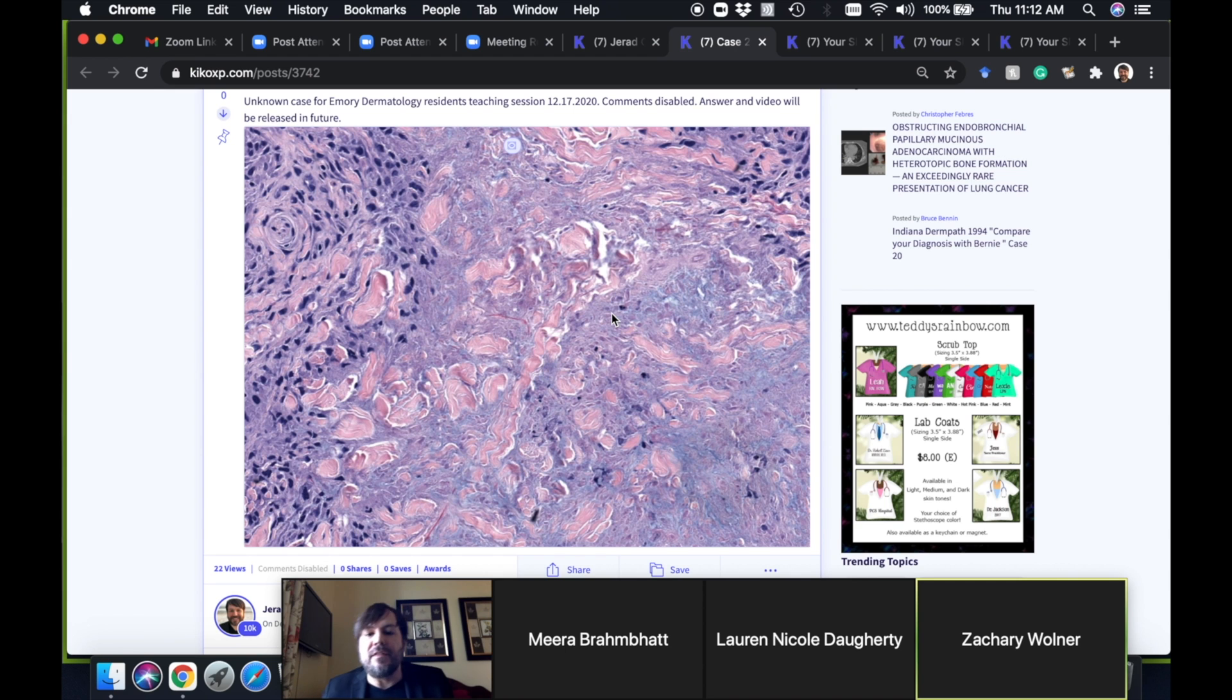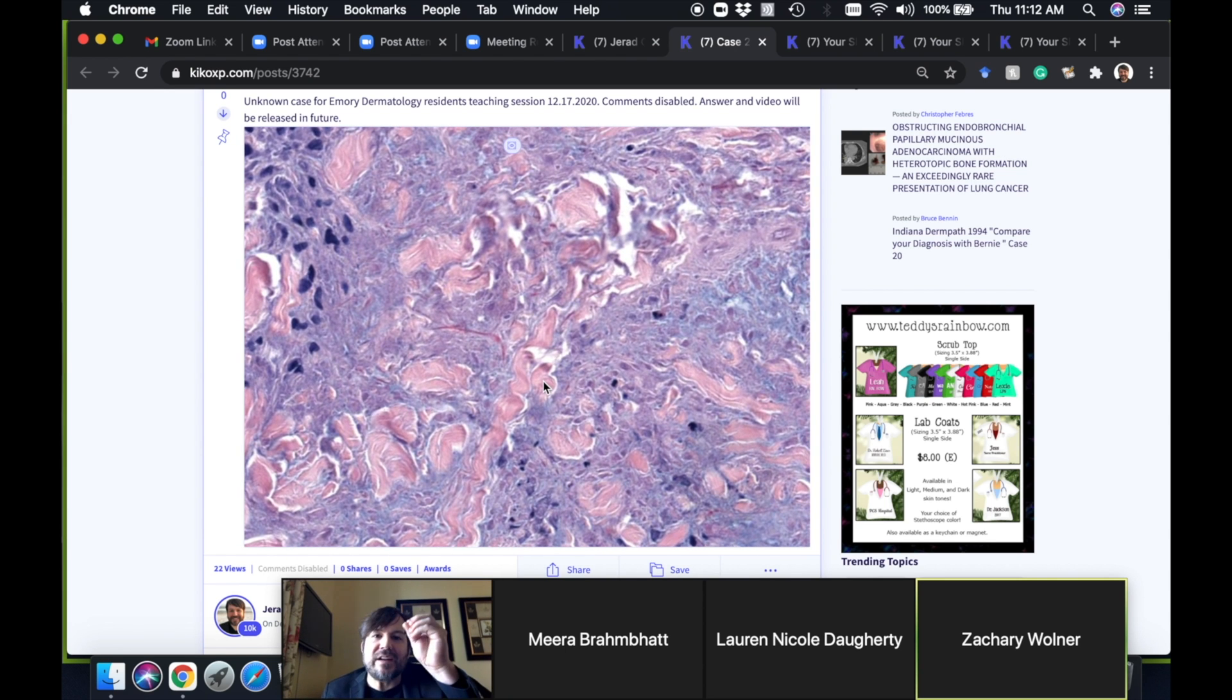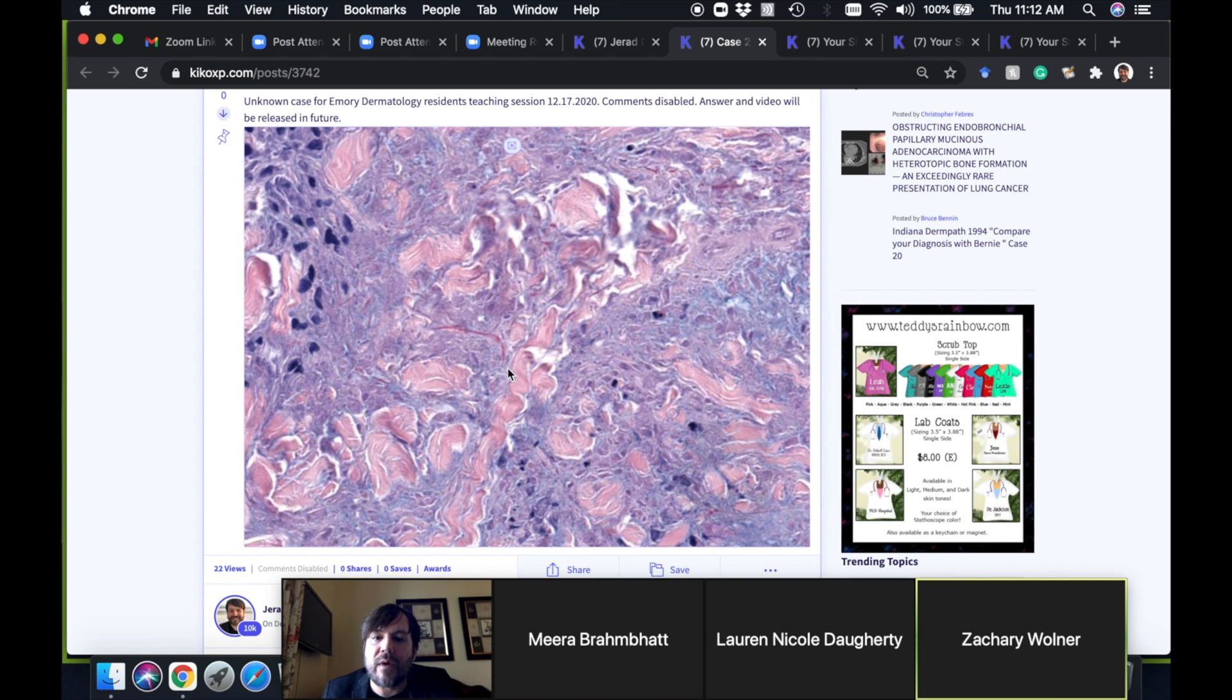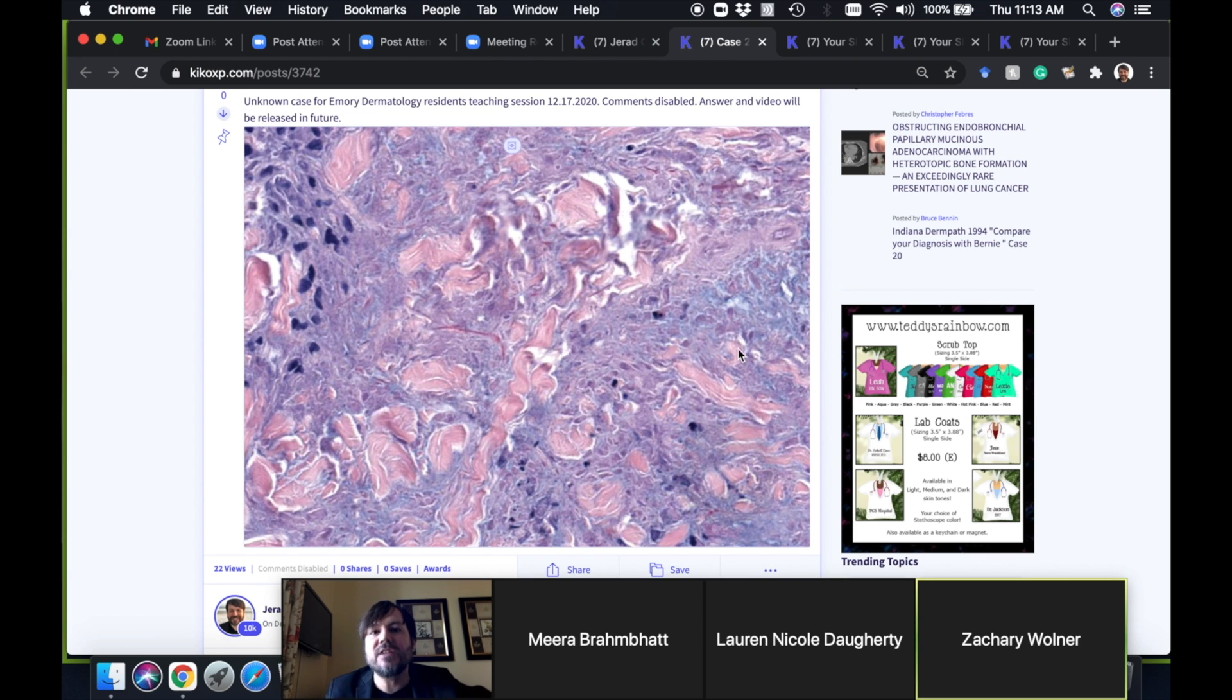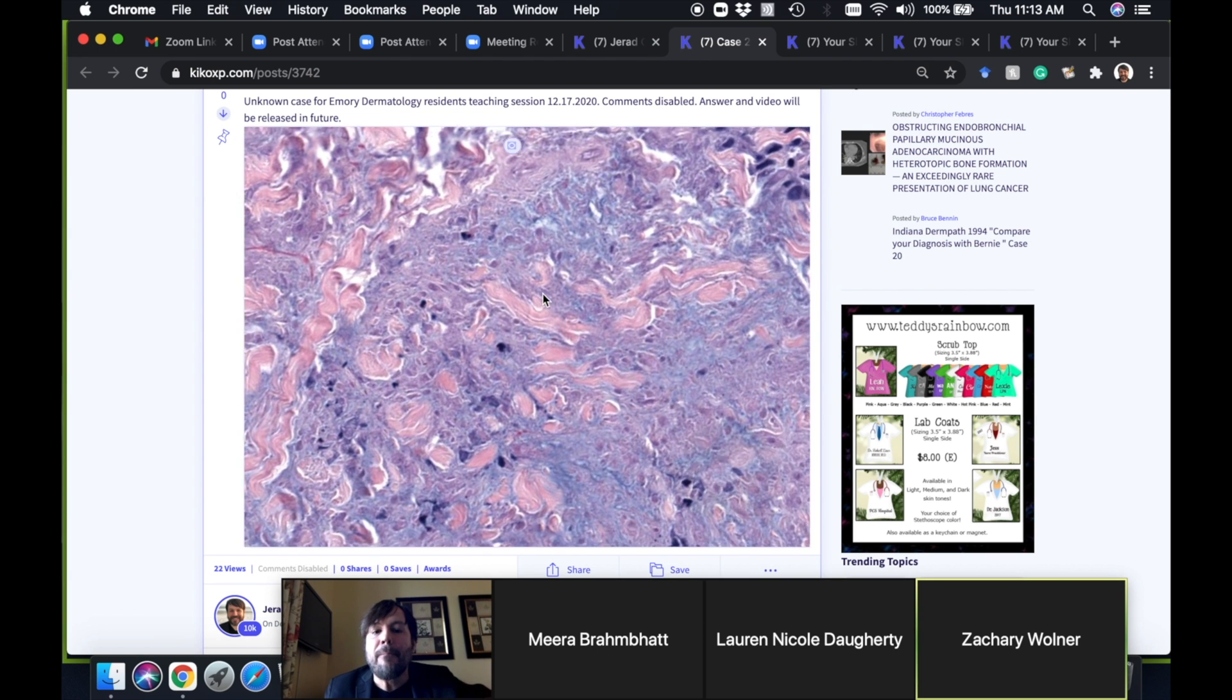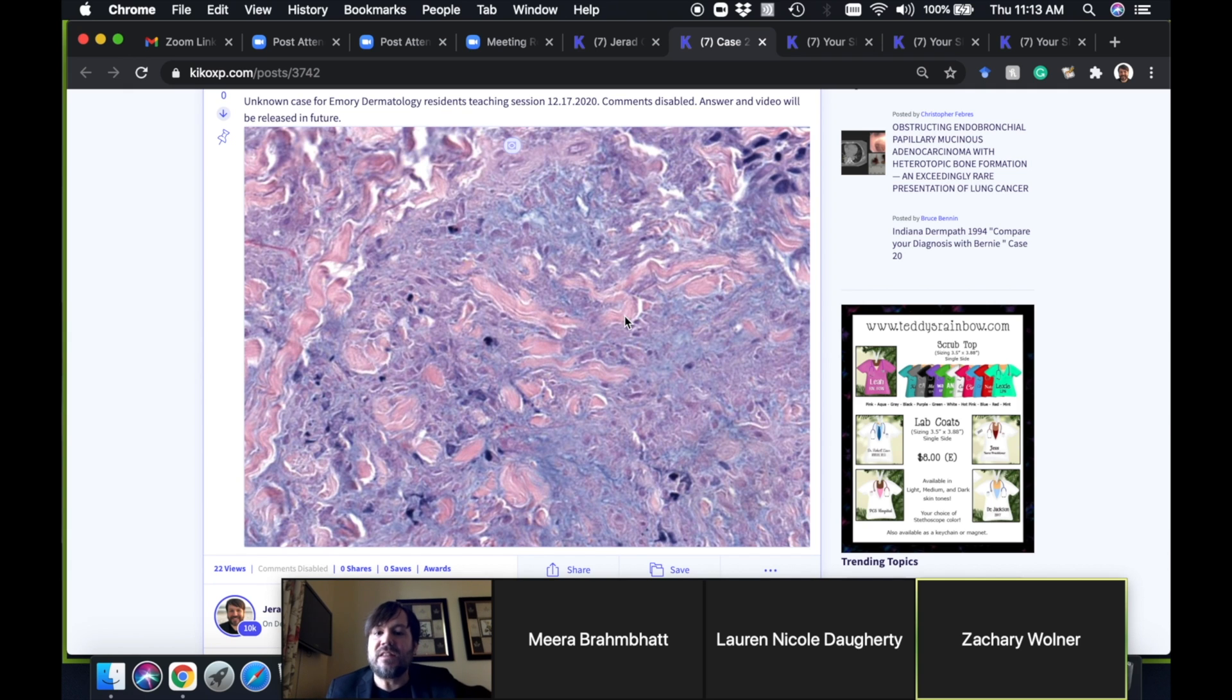The key here is that you have collagen bundles and they sometimes get kind of smudgy degenerated look, but also they don't have corresponding fibroblasts. It's not per se that the collagen has now died, but it does begin to degenerate over time.